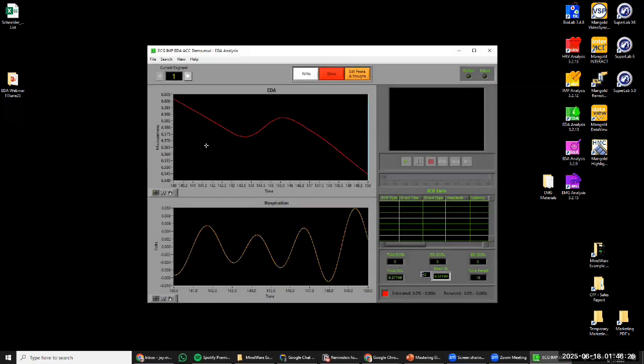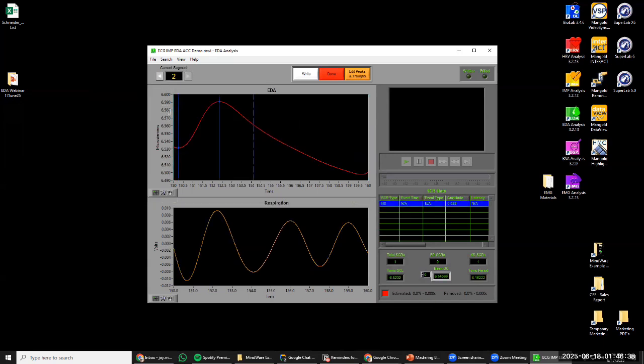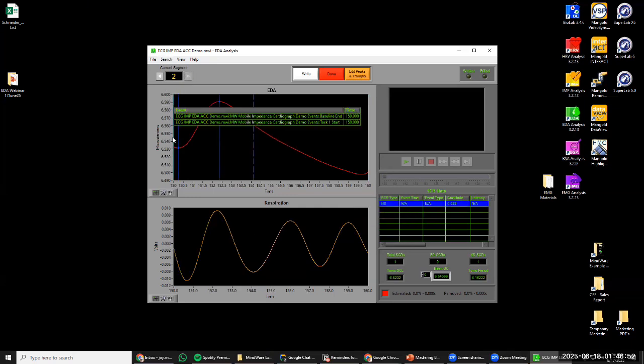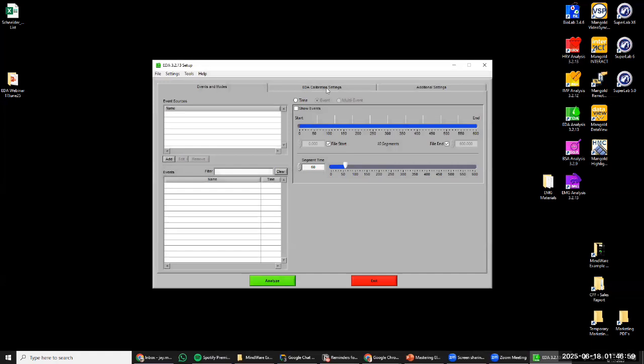So I'm going to show this real quickly here. We have the 10 seconds before. Here's our task one onset. At a very basic level, we could ask what is the mean skin conductance for this segment. And then jumping forward, we can see that same task one start, so essentially this is the 10 seconds afterwards. Here's the mean level. We didn't have any SCRs. And then once the actual event occurs, we have an SCR that occurs right away, and we have a change in the level. So that's one way in which that mode could be used.